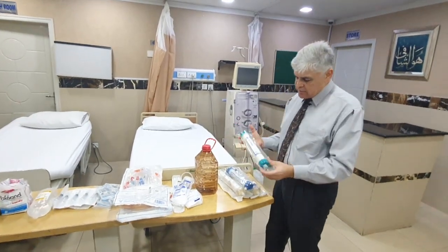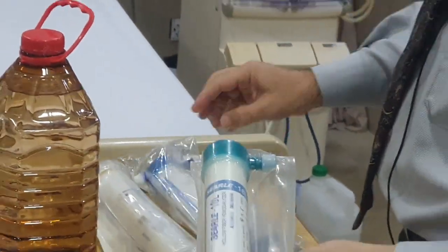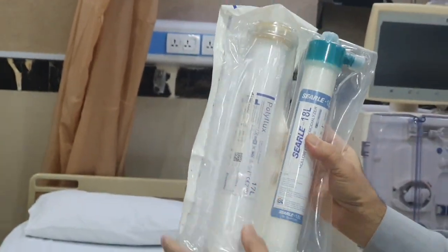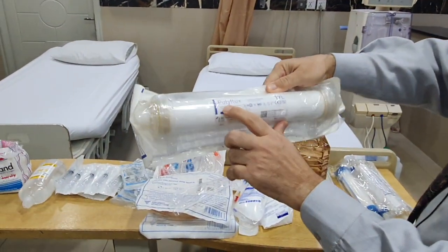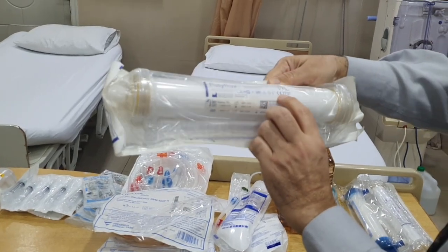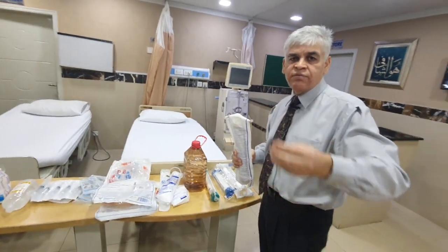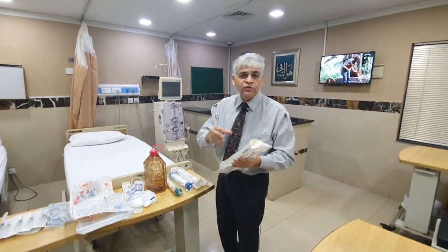Lastly is the dialyzer as such. Now, when you see dialyzers, you'll see that they are of different sizes. They're more or less of the same length, but of different breadths. And the dialyzer tells you a lot. If you read the dialyzer, you'll see that this is a polyflux dialyzer, it's a capillary dialyzer. It tells you about the size of this one. So this is a 1.7 dialyzer, and what the meaning of 1.3, 1.4, 1.7, 1.6 is, is that this is the surface area of the dialyzer membrane.